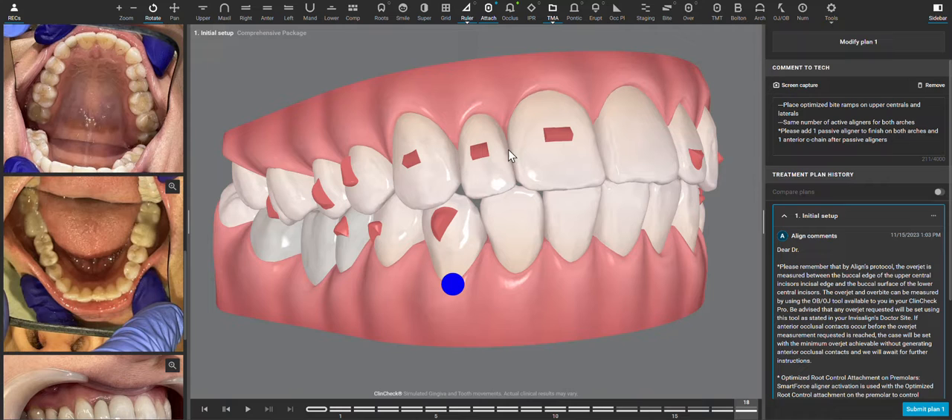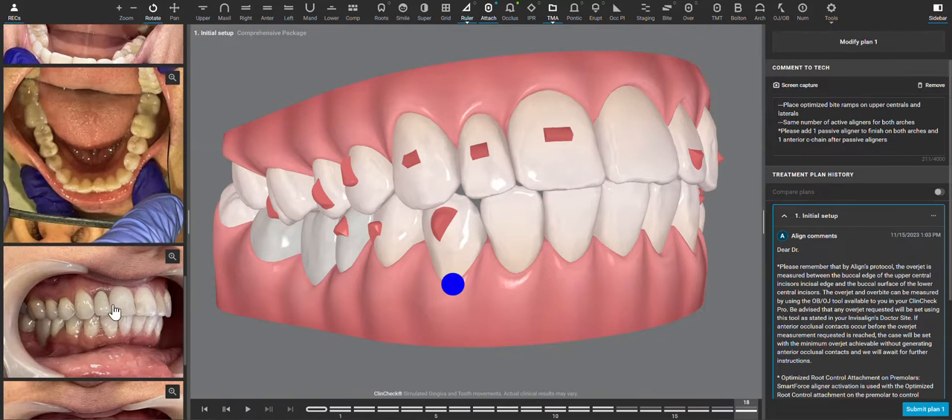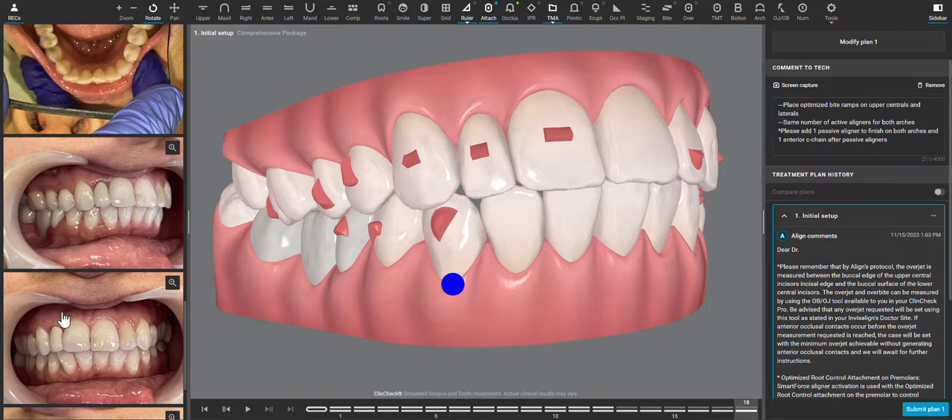We also want to create this space here for that restoration, and the photos are really helpful — these are really good photographs to see that the patient probably doesn't have a lot of anterior buccal bone here. So when creating the space, I'm going to focus on translating or tipping the premolars to widen the arch to create that space, rather than just bringing these centrals buccal.